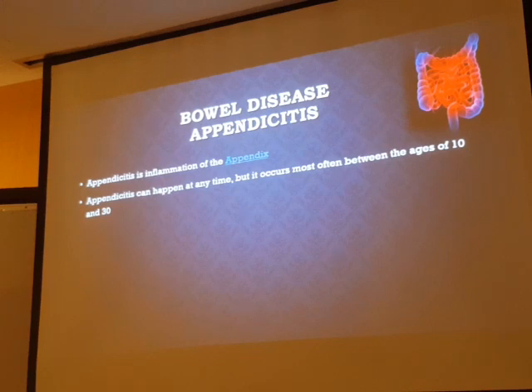Appendicitis is the most common on-call case. Every on-call you have appendicitis, to rule out appendicitis. The patient will come with lower quadrant pain, with vomiting, nausea, high white blood cells, and right away ultrasound. They will not refer pediatric patients to CT. They will not expose the patient to radiation. The ultrasound can exclude it and give them information. So you have to have a proper technique, proper examination.